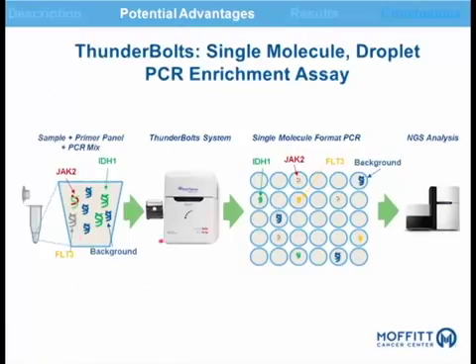I'm not going to go over this, but when we say single plex, what we mean is that the droplet generation allows for one genomic template to interact with the primer pools. And the hypothesis, at least in our lab, was that this methodology may allow equal amplification of genomic template and minimize amplification of deamination reactions.